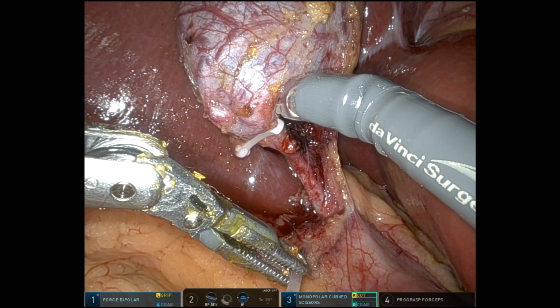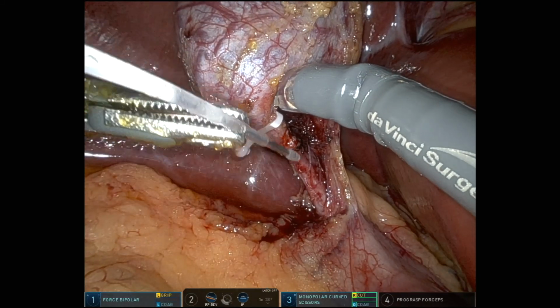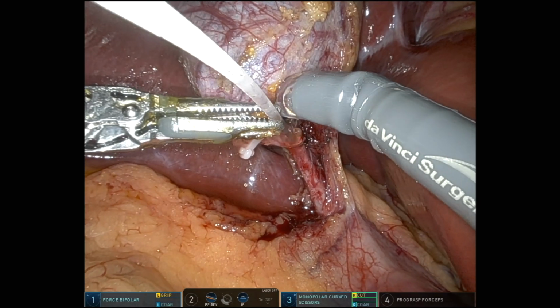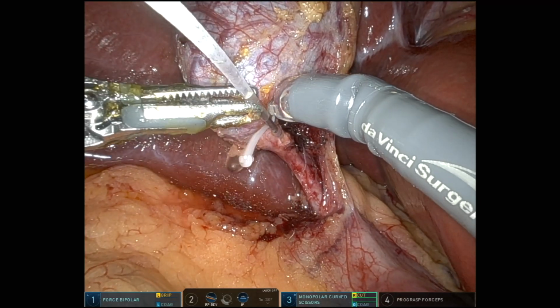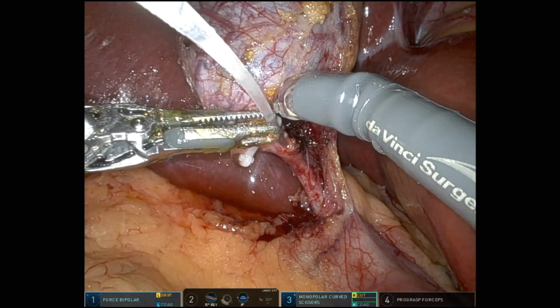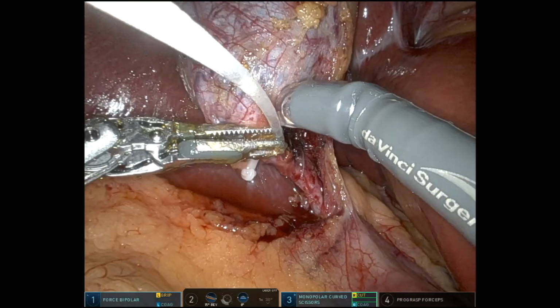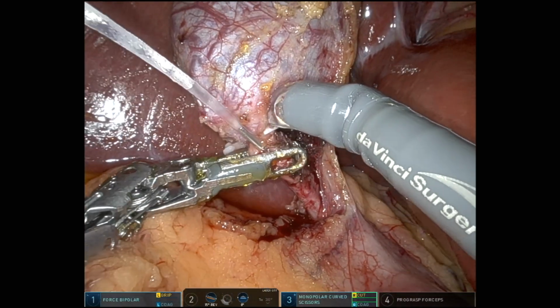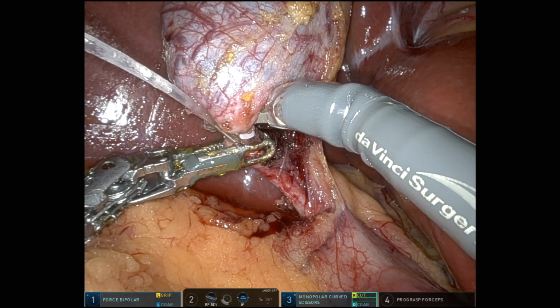In this first case, the surgeon's left-hand grasper simply grabs the tip, which cannot be crushed by the robotic grasper. The tip is inserted a few millimeters into the duct, and then it dangles in what appears to be a precarious position. The ductotomy site with the dangling tip is then simply grabbed by the same instrument.